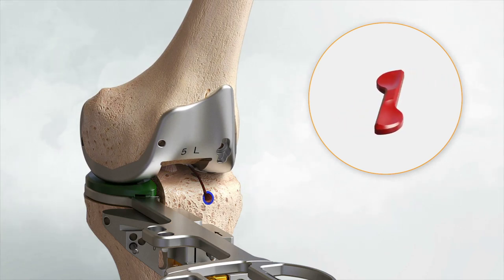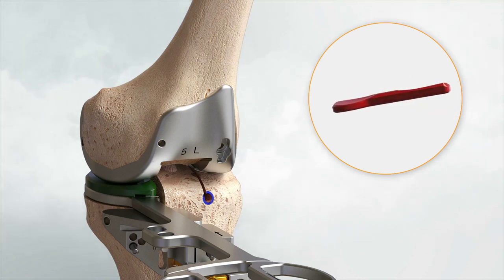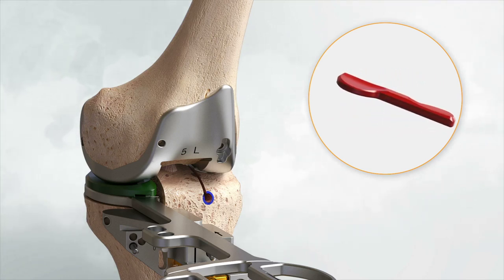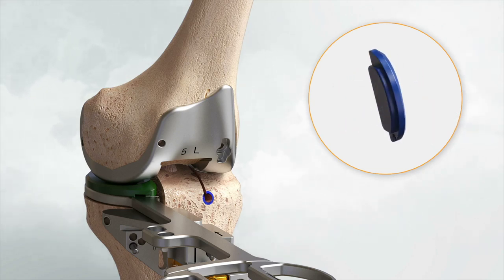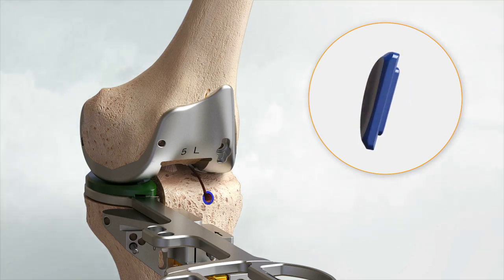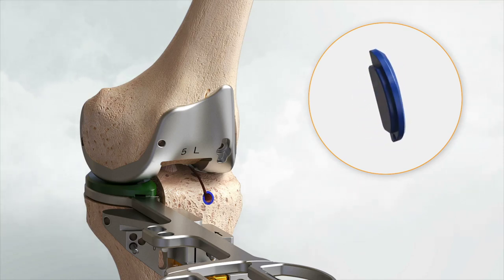If the flexion space is tight relative to the extension space, down-sloped insert trials are available to simulate a 2-degree recut of slope. In this scenario, a 5-degree cutting block can replace the 3-degree primary datum block. Be sure to prepare for the lateral resection by re-drilling the lateral eminence hole through the orientation stylus after it is attached to the datum block setup for the recut. Blue insert trials represent implant options for laxity in flexion relative to extension — less posterior slope — and each blue insert trial corresponds to an insert implant option.